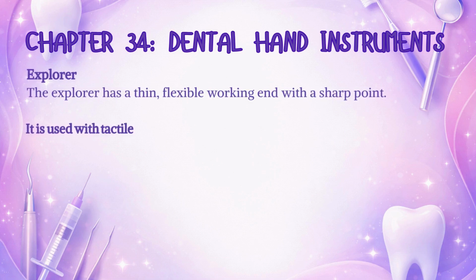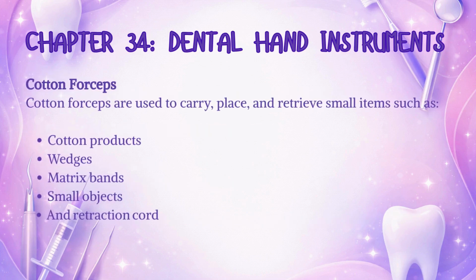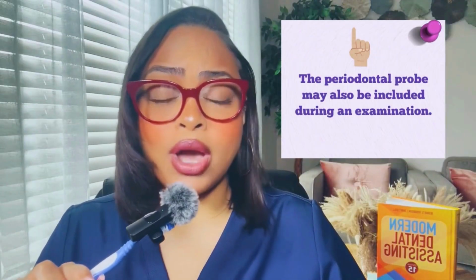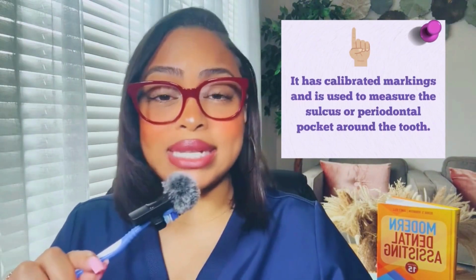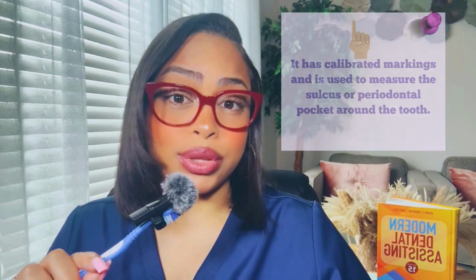The explorer has a thin, flexible working end with a sharp point. It is used with tactile sensitivity to help detect calculus, surface irregularities, and areas that may indicate decay. Common explorer designs include the pigtail, shepherd's hook, and Orban explorer. The cotton forceps are used to carry, place, and retrieve small items such as cotton products, wedges, matrix bands, small objects, and retraction cord. The periodontal probe may also be included during an examination. It has calibrated markings and is used to measure the sulcus or periodontal pocket around the tooth.